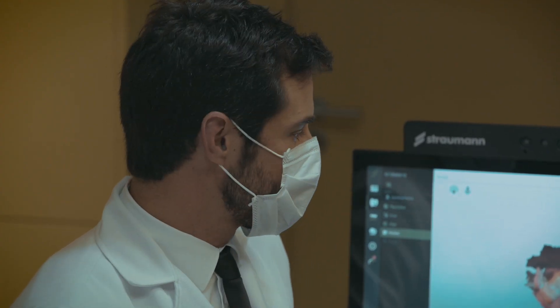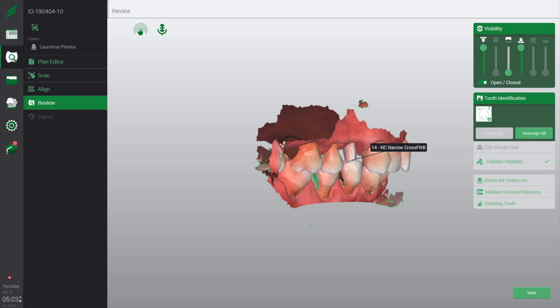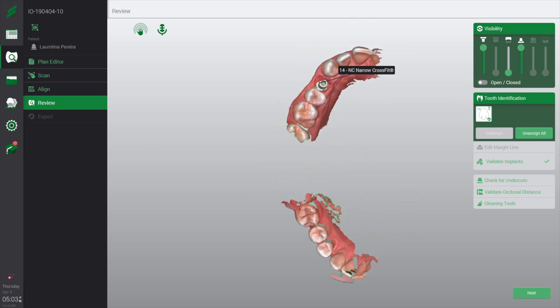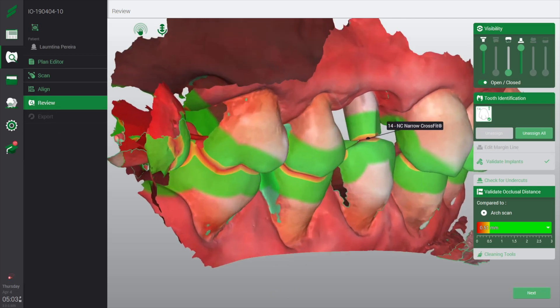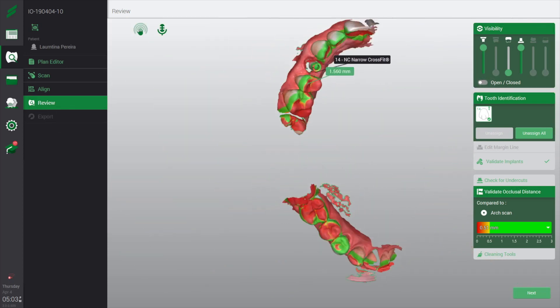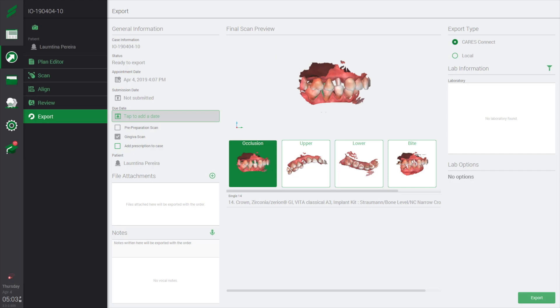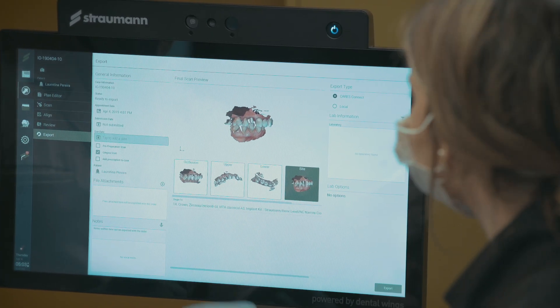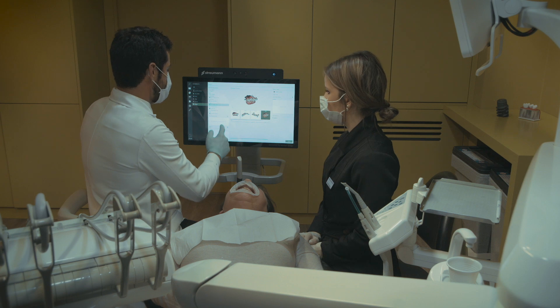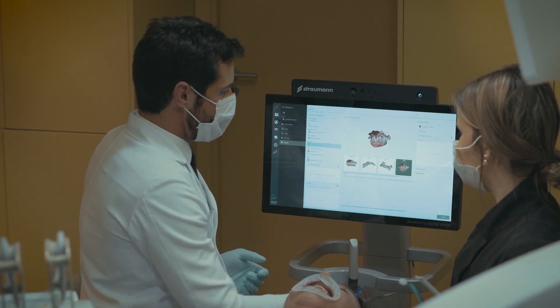Now we have our final scan and we want to check if we have enough space for our final crown. You can check visibility, and validate occlusal distance — in this case, we can see that we have enough space. You can open and see the contact points on occlusal surfaces. You can check if everything is okay, do your lab information, add notes and attachments — pictures or anything else you want — and then send to the lab. Easy and predictable and efficient.